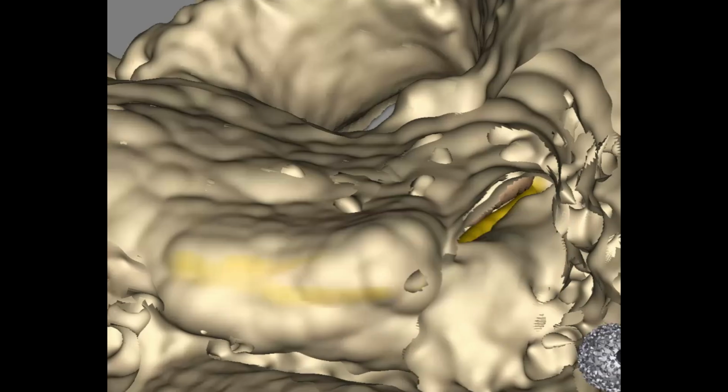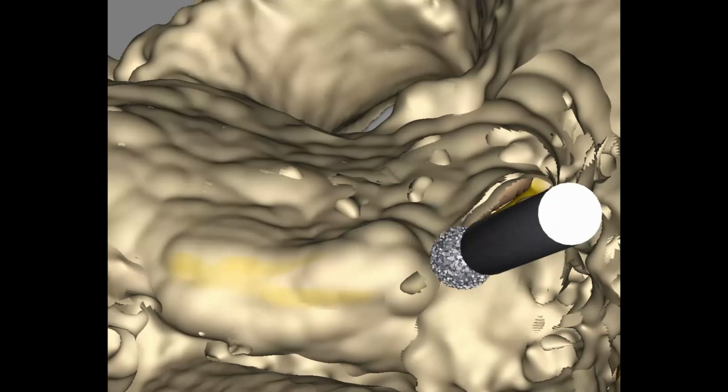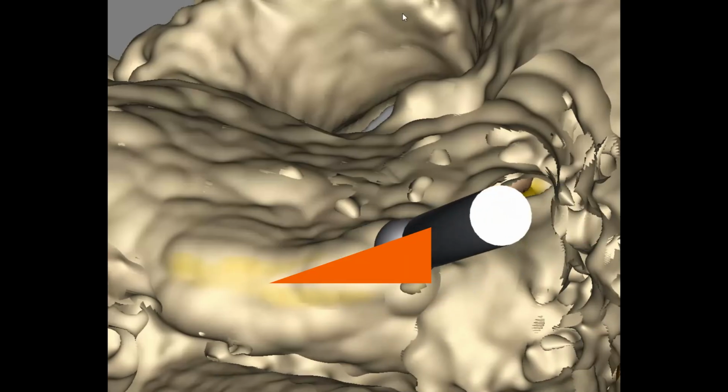In this screenshot, you can just appreciate the yellow of the facial nerve trunk and chorda still covered in bone. In reality, it is usually not so clearly seen. The bone between these two nerves, shaded, is what needs to be drilled through to perform the tympanotomy.